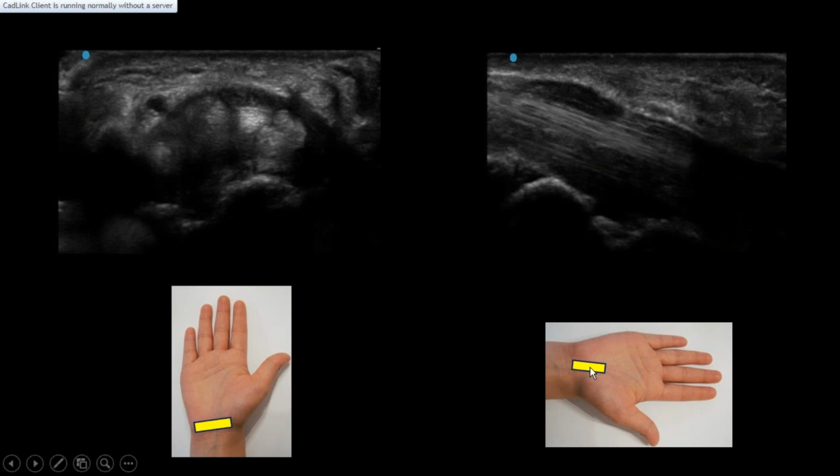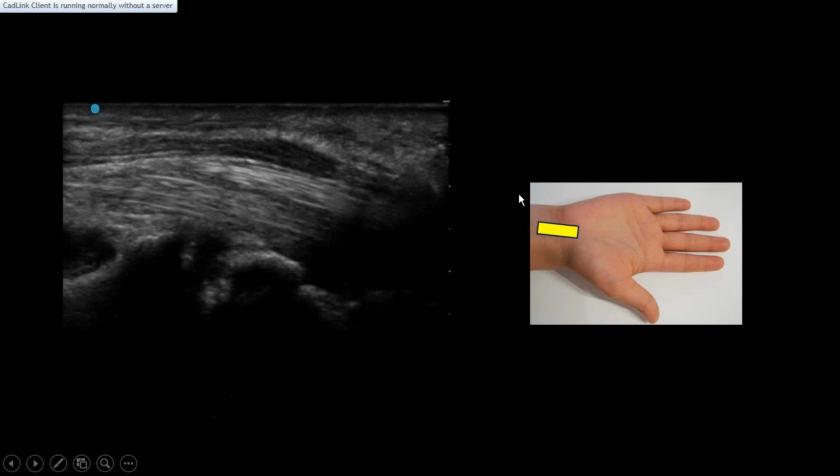So now let's move longitudinally more proximal in the next slide, and you can again see the nerve is normal in its echo texture, proximally and distally, and just focally, at the area of the trauma, there are signal changes. So with ultrasound imaging, you can actually see the structural changes and understand the physiology, and it gives a very good perspective to looking at the problem rather than just looking at the functional aspect and basing everything on just electrophysiological studies.